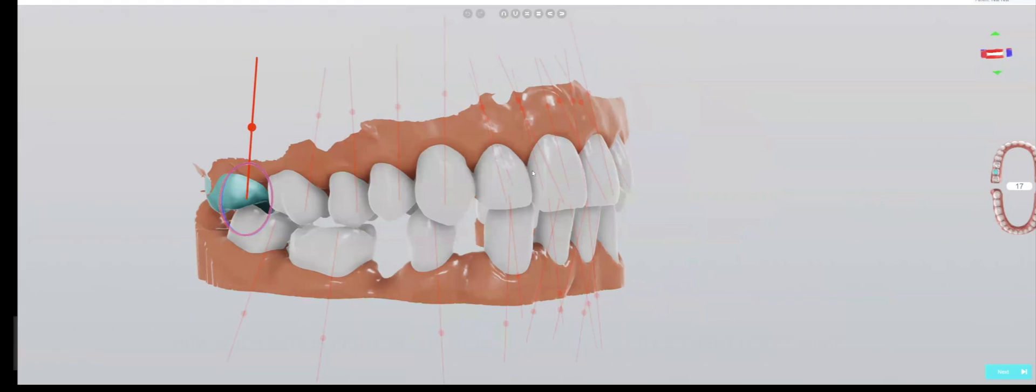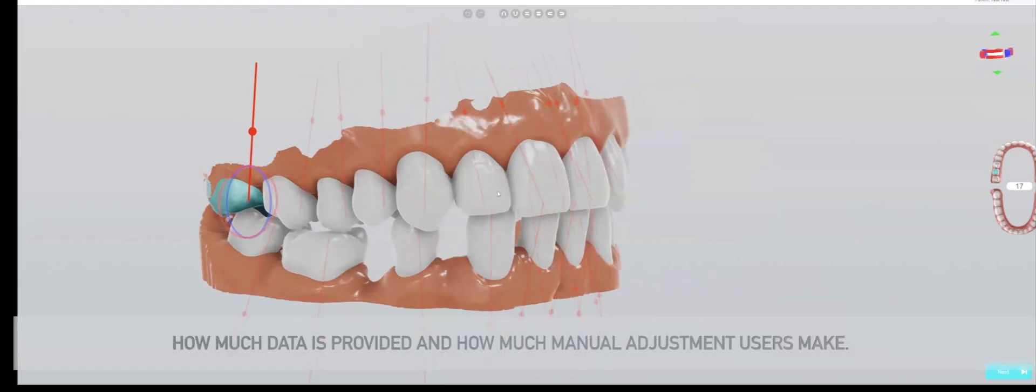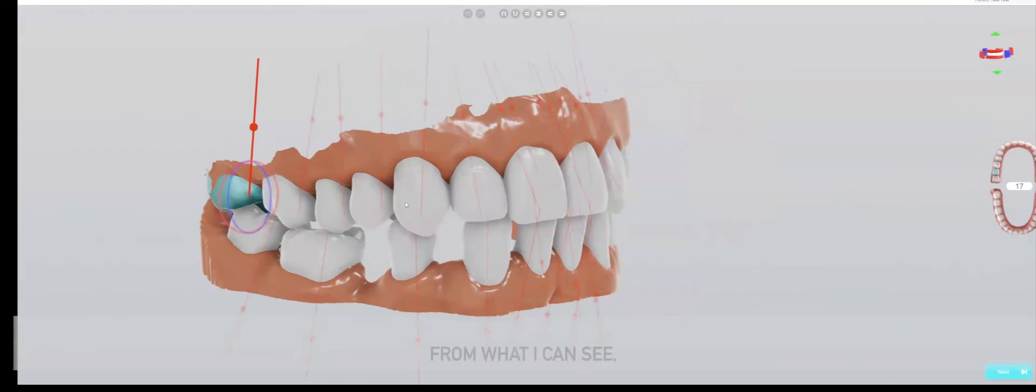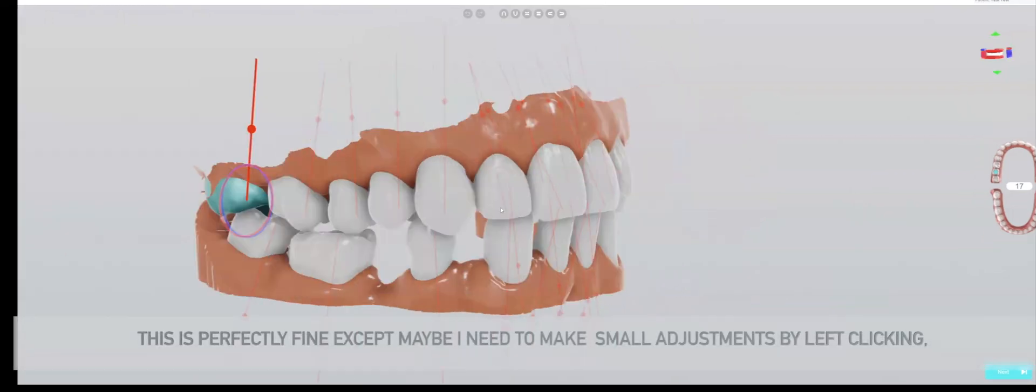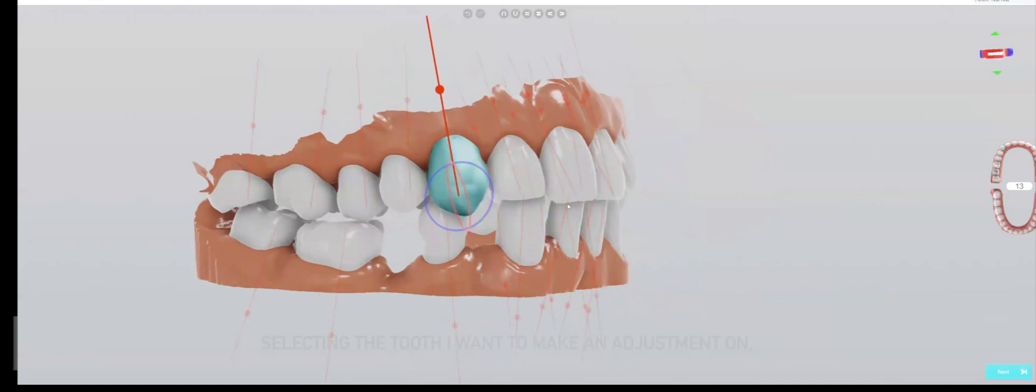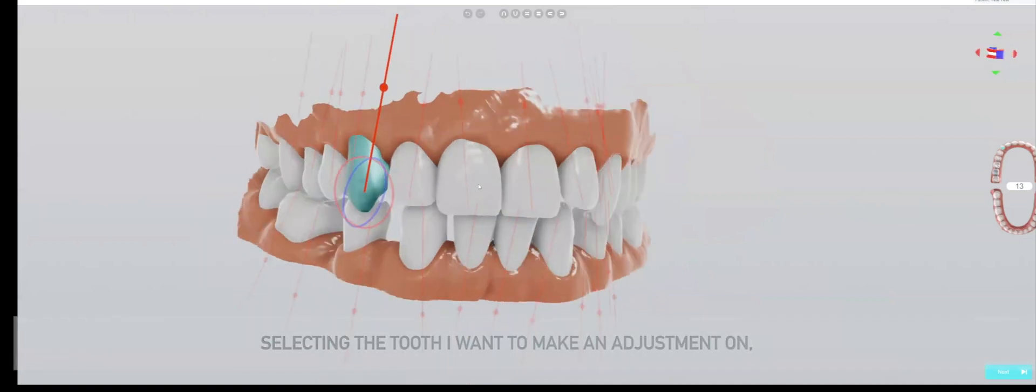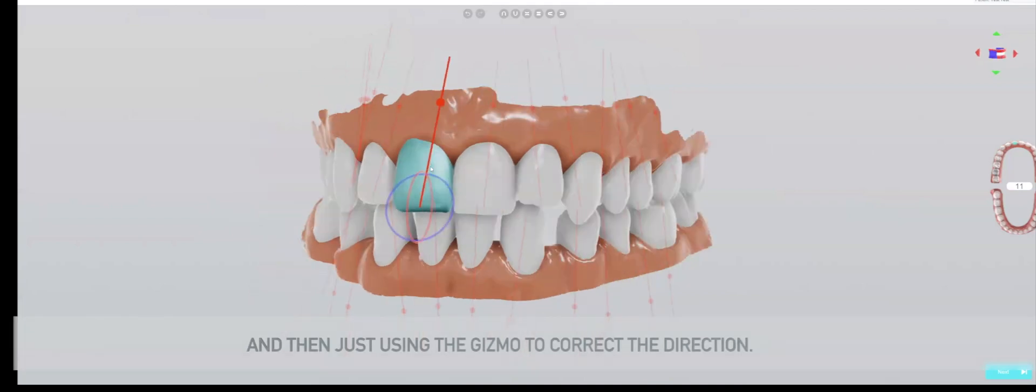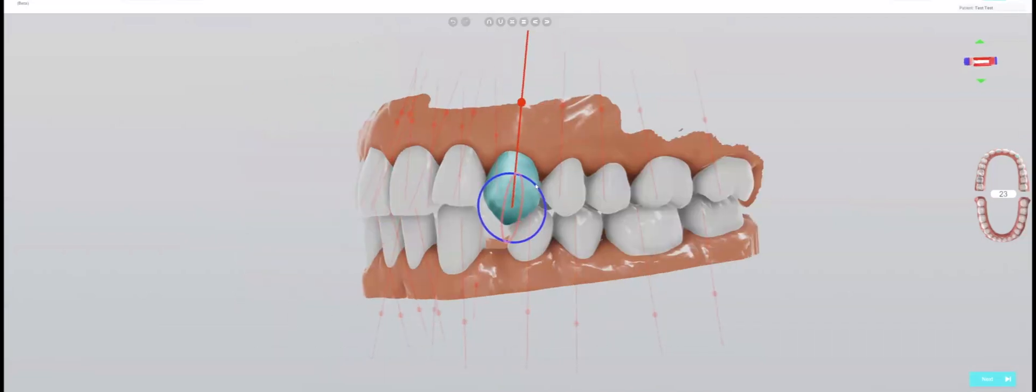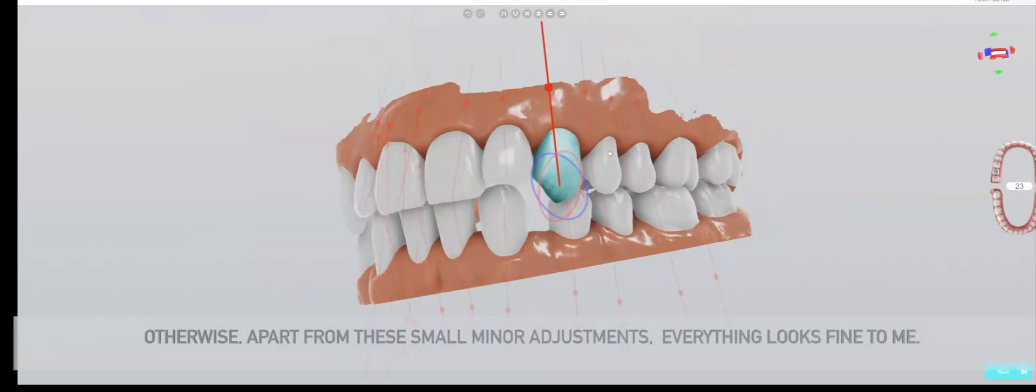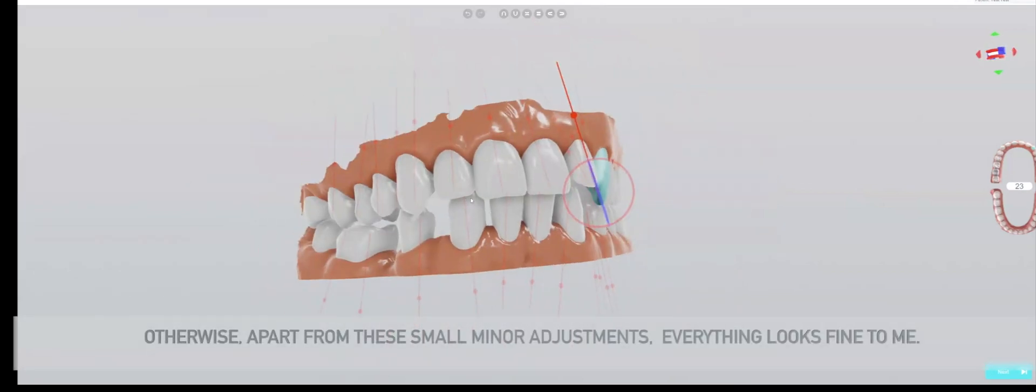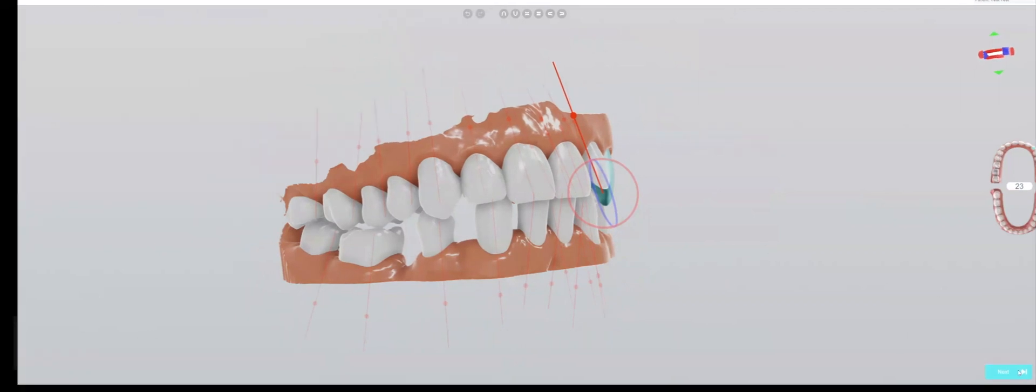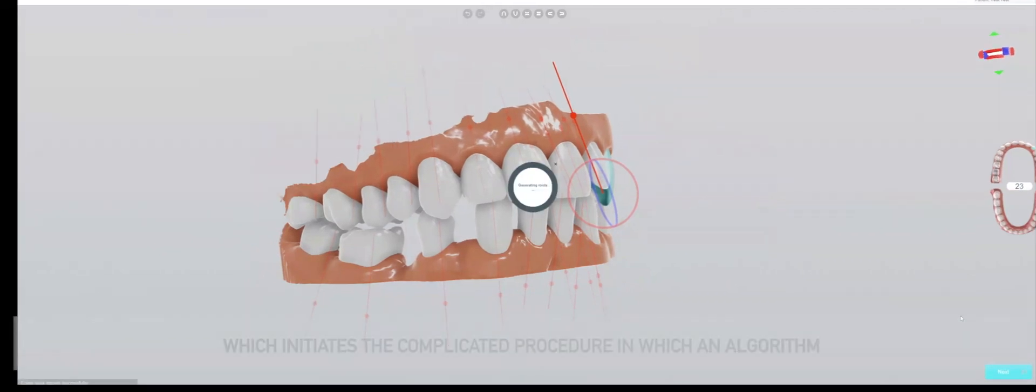From what I can see, this is perfectly fine except maybe I need to make small adjustments by left clicking, selecting the tooth I want to make an adjustment on, and then just using the gizmo to correct the direction. Otherwise, apart from these small minor adjustments, everything looks fine to me. When I'm happy, I click next.